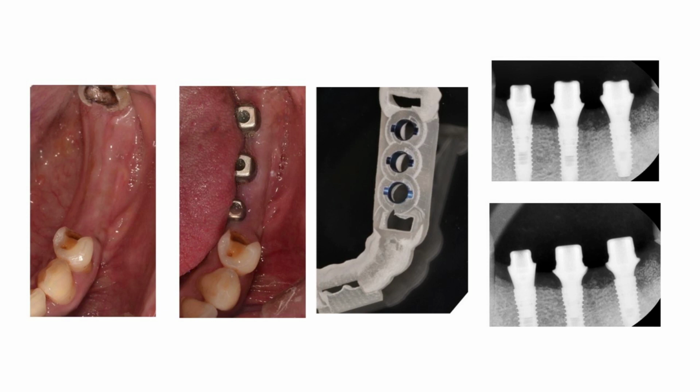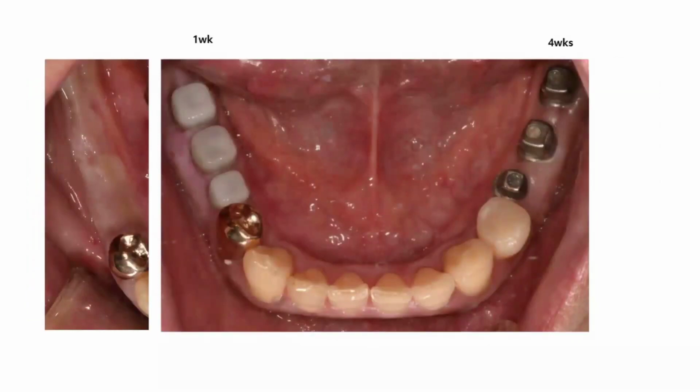And on the other hand, the implantations were done 1 week after. And so we finished the surgeries over a period of 3 weeks, and you can see the first week photo and the 4th week photo here from right to left. Digital abutments also come with a plastic cap, like the one you see on the photos here. This is to protect from the sharp digital abutment shape, of course.